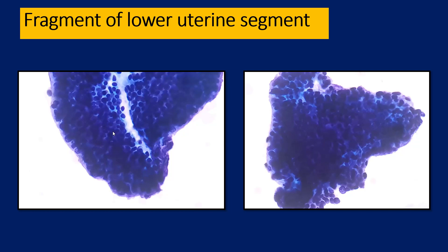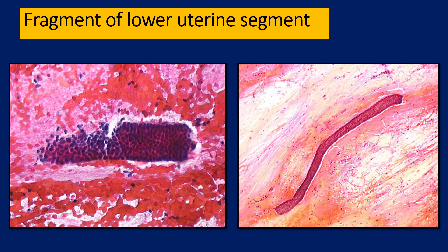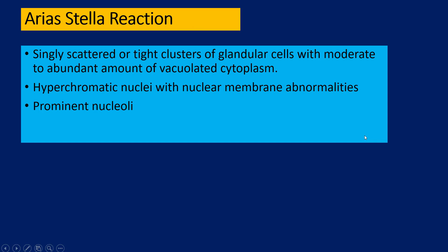We have discussed hyperchromatic crowded group clusters in the previous talk, and lower uterine segments are one of the differential diagnoses. The straight edges are very helpful. Look at the cells at the periphery — you will find pretty round, uniform nuclei with sharp nuclear outlines. There is another one from the Bethesda Web Atlas with this geometric figure — very straight, looks like a rectangle. Sometimes they are present as tall, long organoid structures which are appreciable on low power.